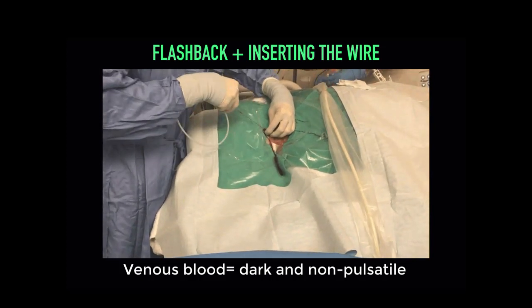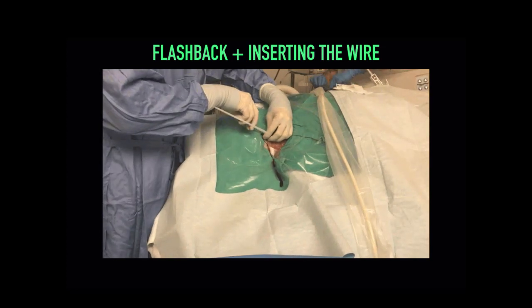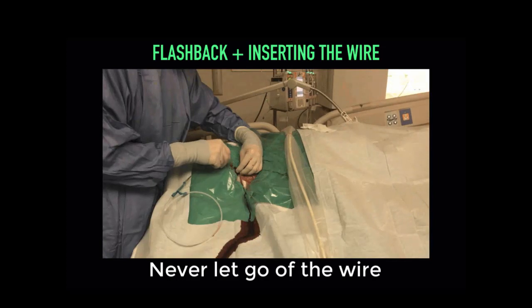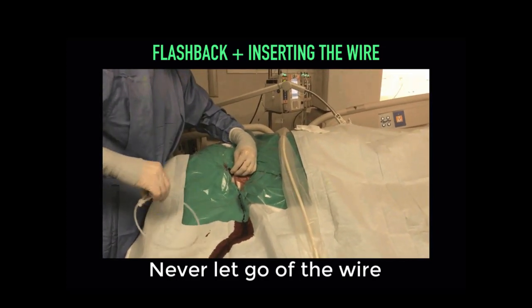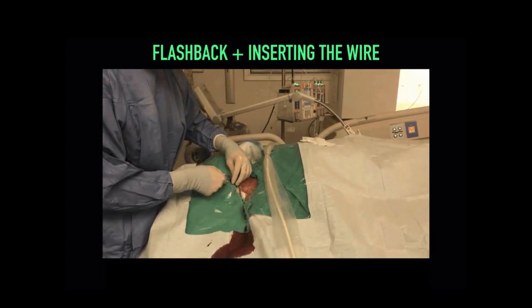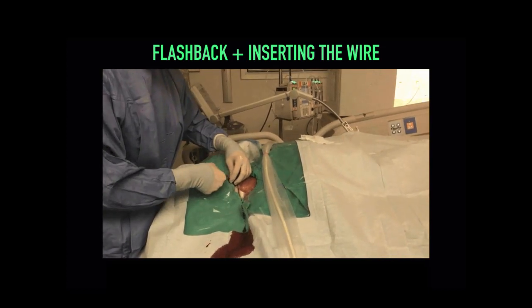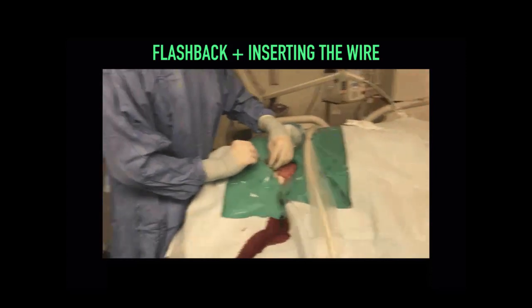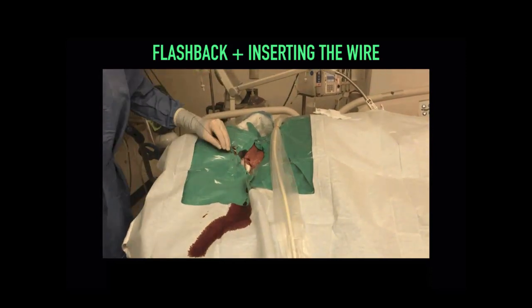Now we can see the wire is passed through this syringe. It should be passed with minimal resistance. Again, being sure to never let go of the wire. Once you're around 2.5 notches or 25 centimeters, the plastic casing can be taken off. Now, as the wire is advanced slowly, you may see an arrhythmia. If so, just remove the wire slowly and this arrhythmia will disappear.